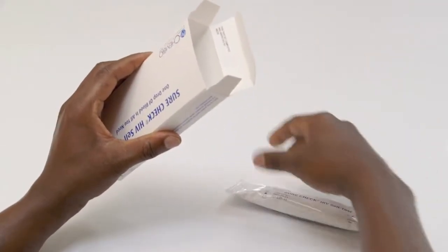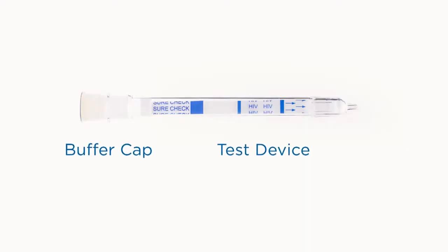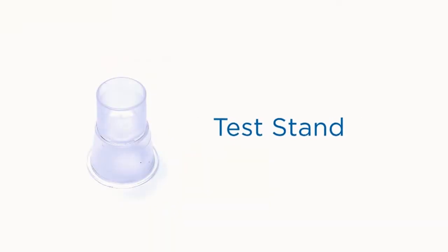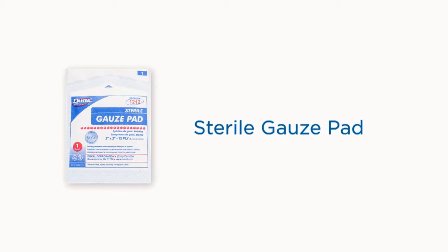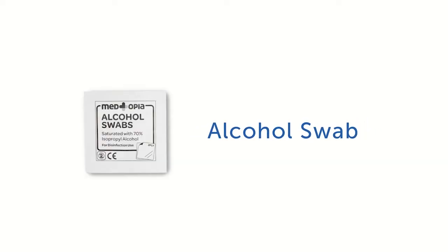The SureCheck HIV self-test contains the buffer cap and test device, bandage, safety lancet, test stand, sterile gauze pad, and alcohol swab.